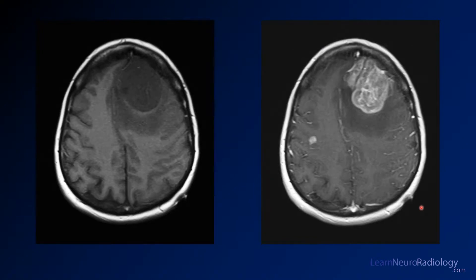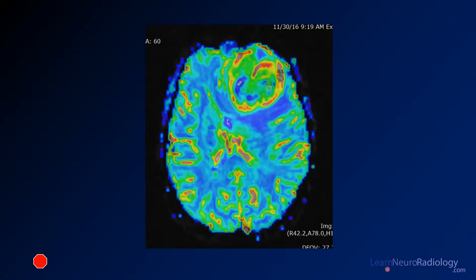And finally we have pre- and post-contrast. One more addition for you: this is dynamic susceptibility perfusion imaging.